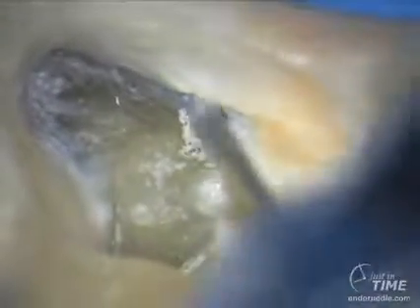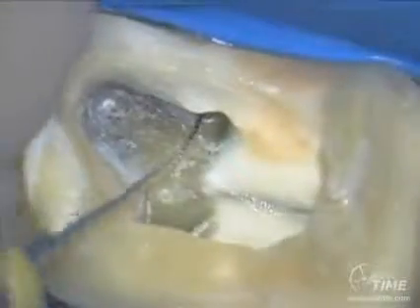I'm using in this case a Gates Glidden 1. A GG1 is only a half a millimeter, but it begins to expand and flare that orifice. And of course, as I expand the orifice, I can see that I need to come back and refine my access, because I have a little deficiency still in the access preparation. So here's the surgical length diamond, again flattening and flaring the mesial axial wall.